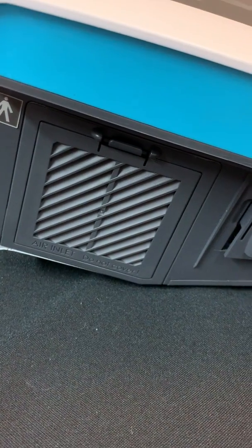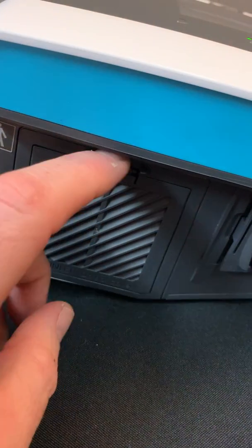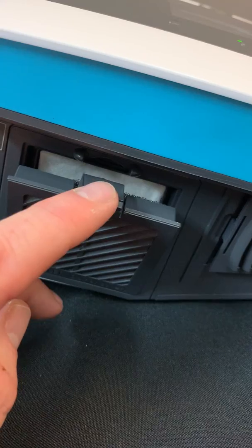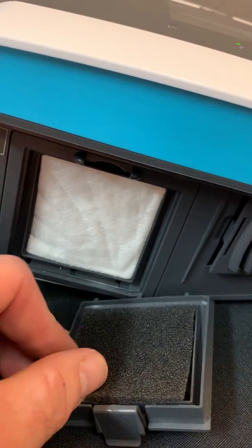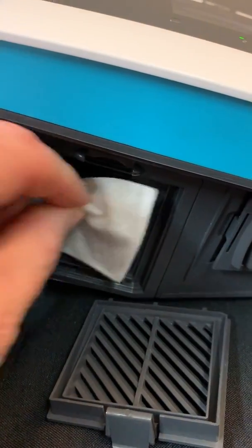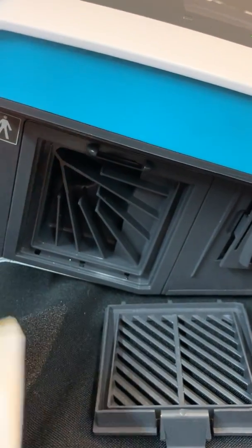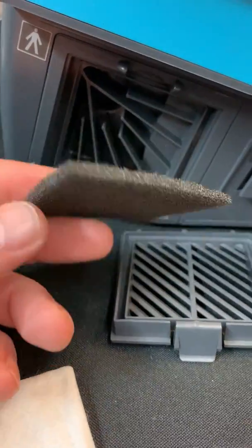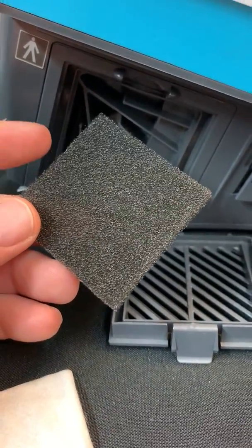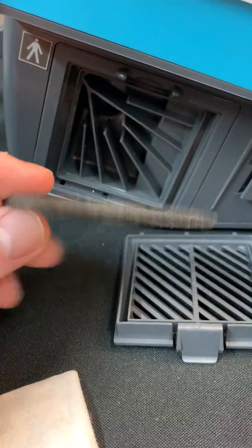So this is the left panel, let's go ahead and get into some details with regards to what you're looking at here. This is the air filter or air inlet compartment. It houses a couple of filters. The first filter is this black carbon filter. It is a carbon filter that can be rinsed and reused.